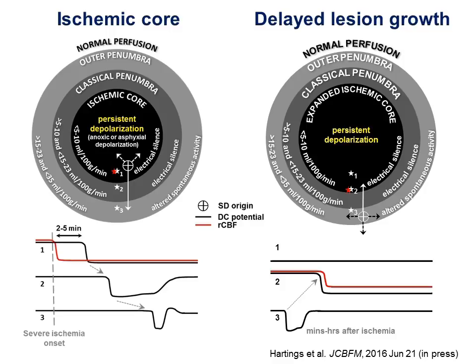Thank you. The next question is, have electrode strips been used for clinical decision-making outside of research protocols? Yes, they have been. There are a few centers, and I think that they're a little bit more ahead of us in Europe on that front than we are. It seems the Americans like lots and lots of evidence before they want to do anything. But there are a number of centers in Europe that are using the data clinically.